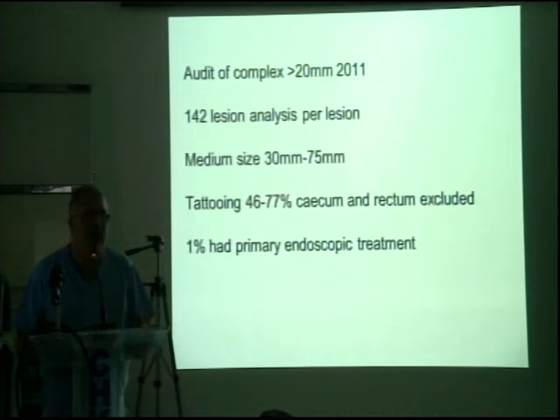Some people use the mix. I'm not a fan of the mix. There's a lot of studies that have gone off. You know the mix where they talk about using gelofusine, putting indigo carmine in, and then putting adrenaline in. Now, you need to go and look and see what the recent studies have shown, which have showed that there is areas of necrosis secondary to the mix itself. And I actually put that down to the adrenaline.